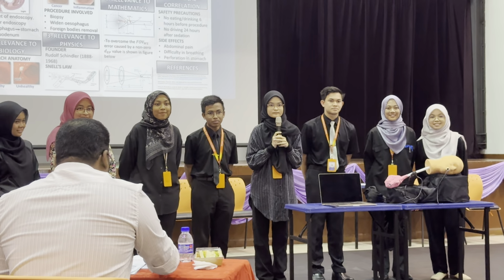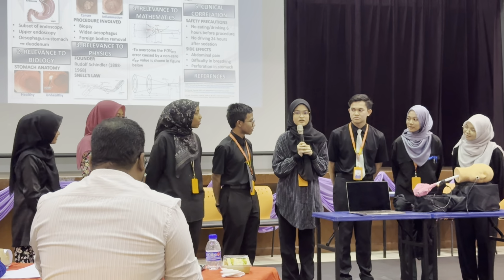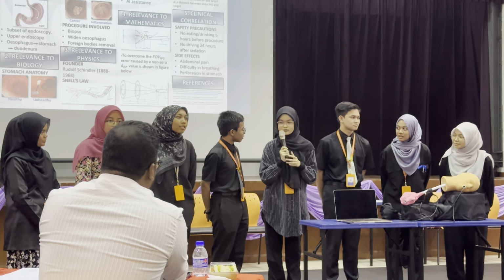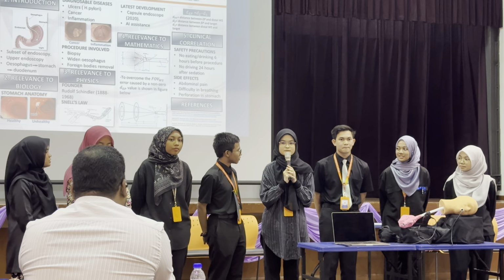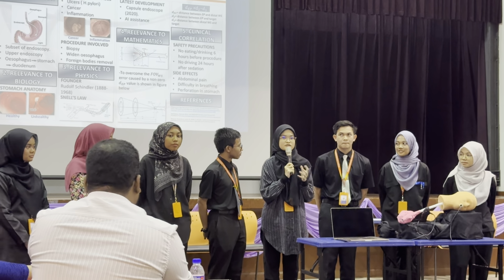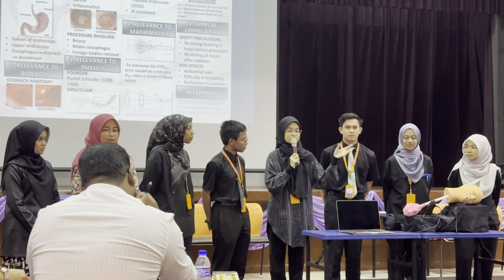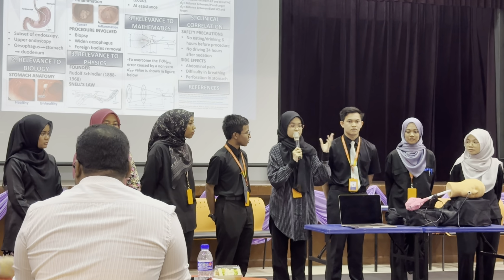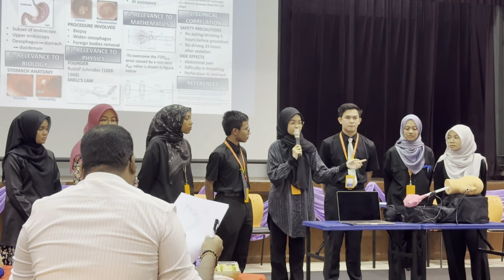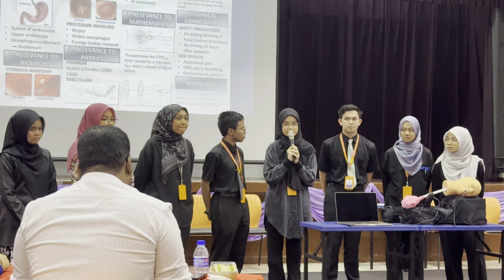Is there a difference between gastroscopy and endoscopy? The main difference is that gastroscopy is just the part where we view the esophagus, the stomach and the duodenum, also known as the upper GI tract.